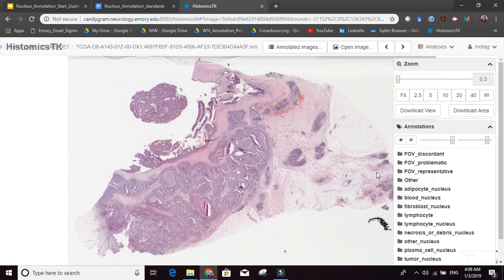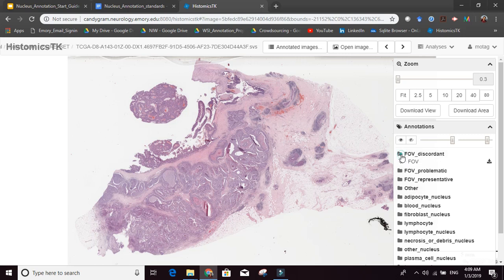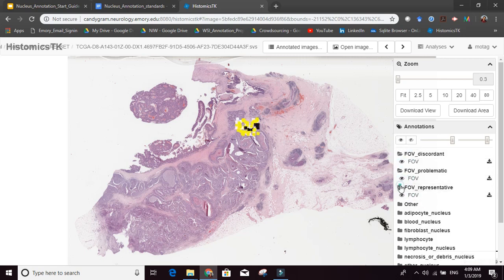After you click Open, the first thing you want to do is get a general idea of where the fields of view are. So you click on this one, and then click on the eye icon. You will notice that all of these have become open. These folder names show groups of annotations, while these ones just show the styles of annotations.